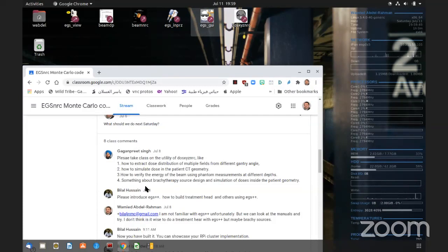You have done it very well. My only objection is that in the uncertainties or the variation, I think you should report everything relative to Dmax, so just take the difference in the PDDs. And you need to do this also for the profiles.